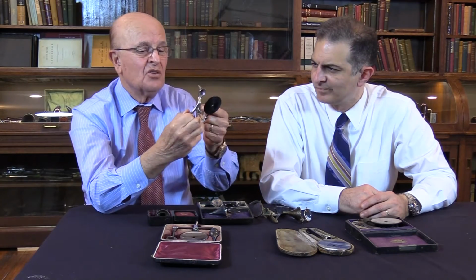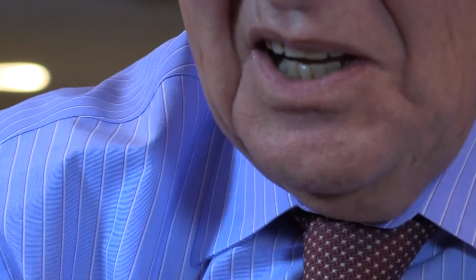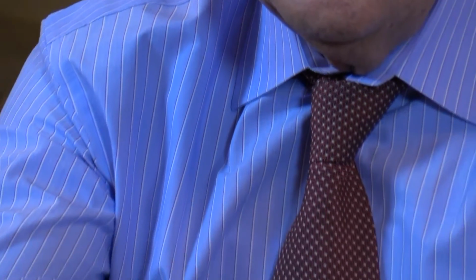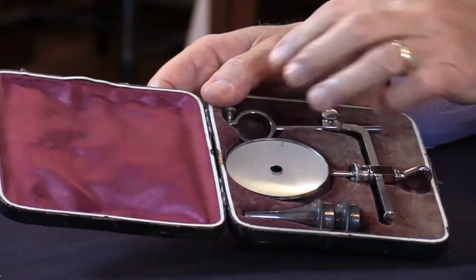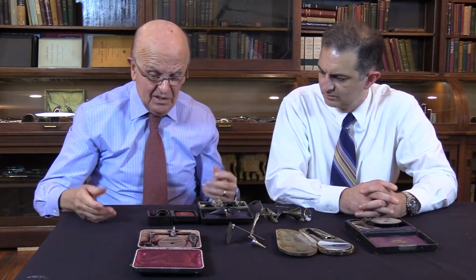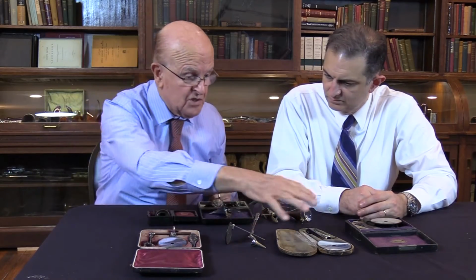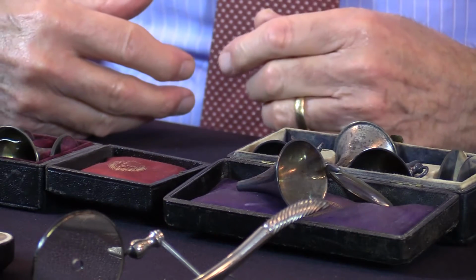This is also a bivalve, but this is called the MIOT, M-I-O-T, ear bivalve speculum, and the difference is it has that gooseneck here. I don't know what benefit it gives, and these things came in a very nice box where you put them together, put the ear speculum here, and use the mirror with one hand, as you said. The other thing that they accomplished: they said, well, we want to see things better, so they started getting magnification lenses.